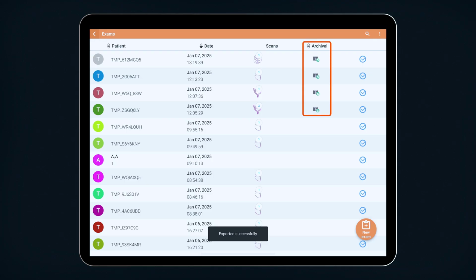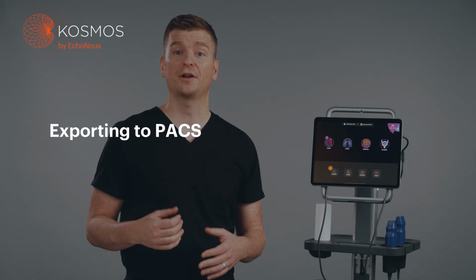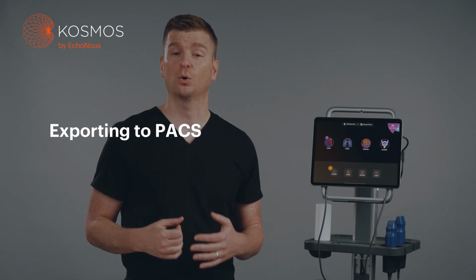For either export method, a green check mark will appear in the archival column, letting you know the system exported the exam successfully. Let's review how to export to a PACS system or cloud storage solution.